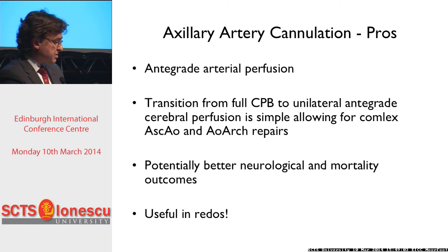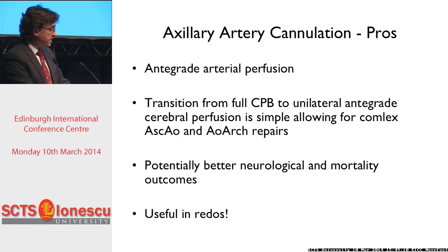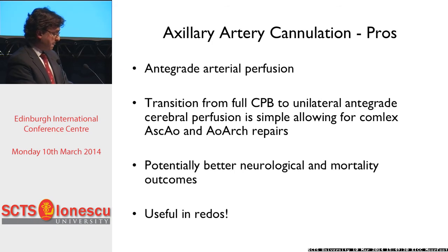Axillary artery cannulation advantages: very easy for antegrade. It's an antegrade arterial perfusion. It's very easy to change from cardiopulmonary bypass to unilateral antegrade cerebral perfusion. And it allows for complex ascending aorta and aortic arch repairs. There is a trend towards better outcomes in terms of stroke and mortality. And it's also very useful in redo situations.